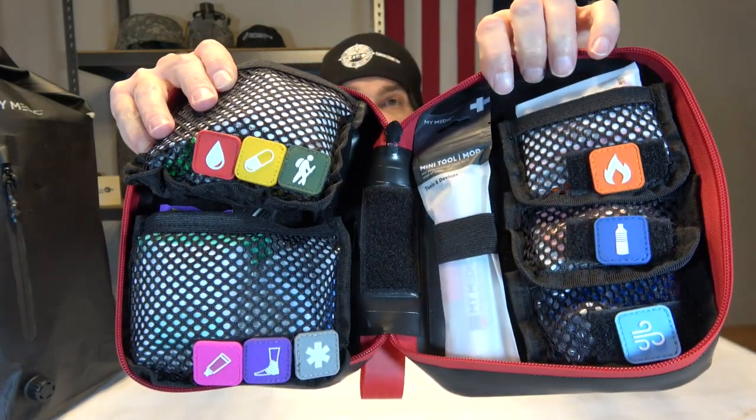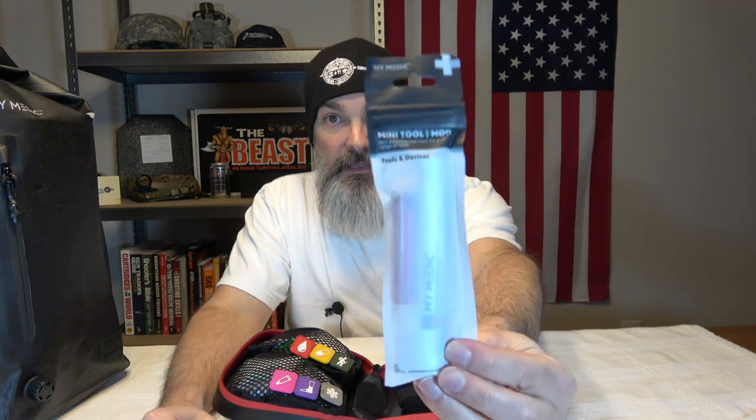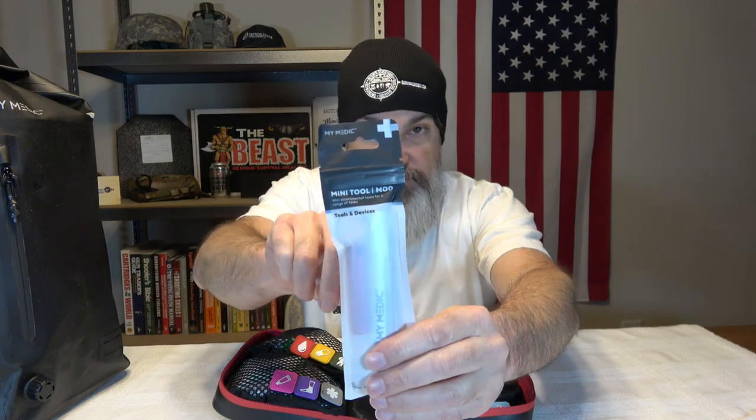Everything has its own little pockets — every kit has its own spot, and it's all laid out really nicely. You do have some Velcro right here in the middle if you wanted to add something to the kit yourself. The first thing here is a mini tool, and this contains a whistle, a pin light, and a pair of tweezers. The packages have tear notches and Ziploc. I really don't want to open all this stuff — drop a comment if you want me to.